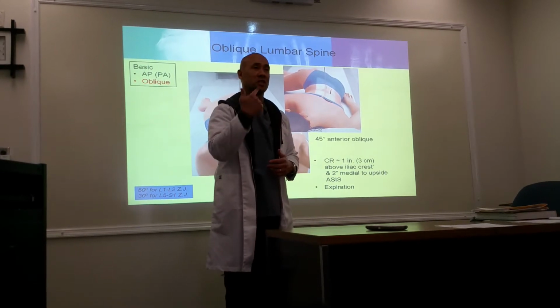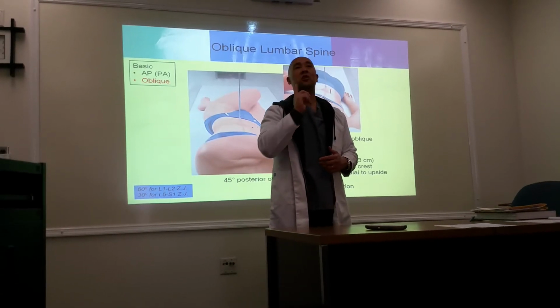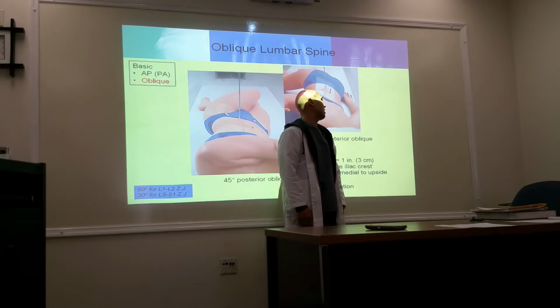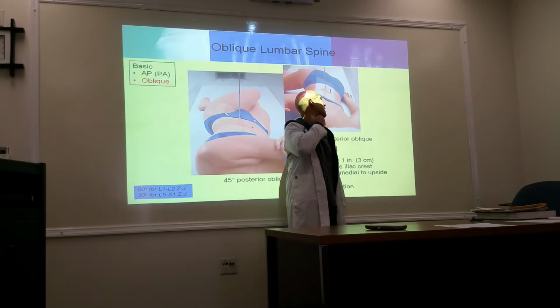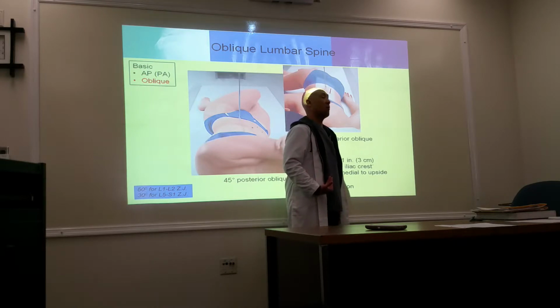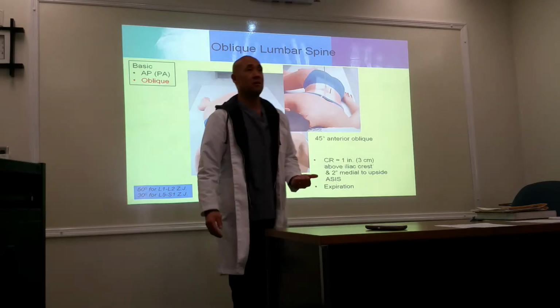Yes, that's what I was gonna say. Sternocleidomastoid, it lines up with the spine. So when you roll them up on the side like this, have them turn their head, and this muscle right here lines up with the spine. Or the EAM also. There's a lot of tricks to this.